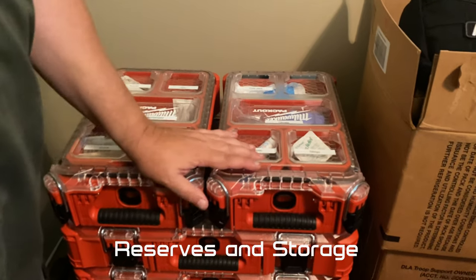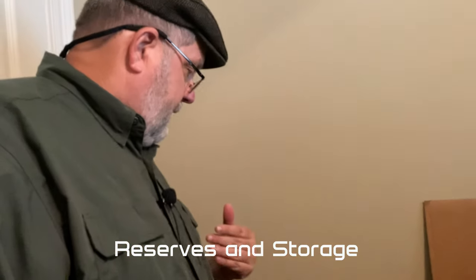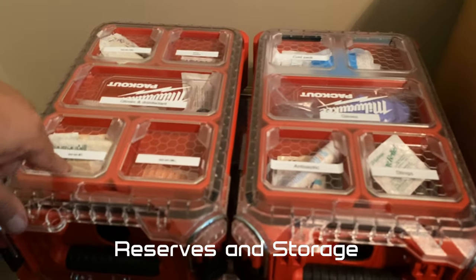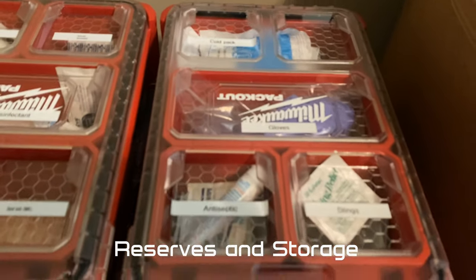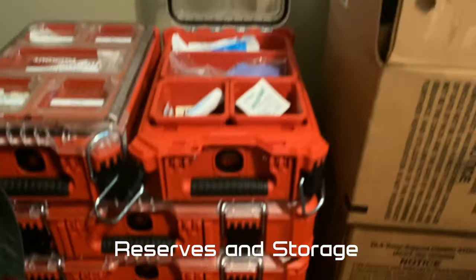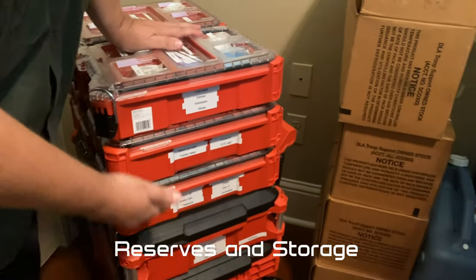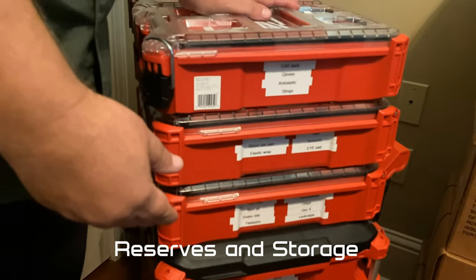And what I've got here, based on our risk assessment process, where you analyze the risk, that's how these are packed. So things that are more likely to happen, I want them up top. So stings, regular Band-Aids, disinfectant, cold packs, these type of things are up on top. And real easy, just pop these off and I can get to the supplies. The other nice thing about this, if I pull this out, you can see on the side that each container also tells me what's in it, so I don't have to spend a lot of time looking through each container.